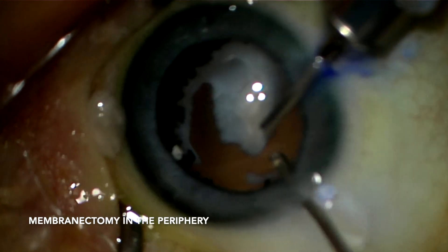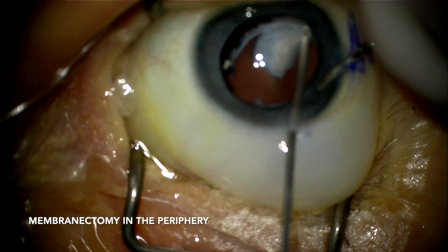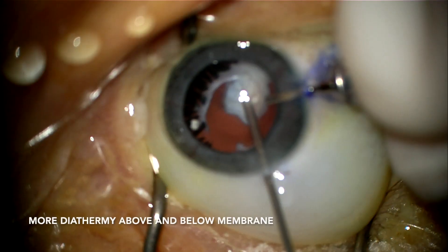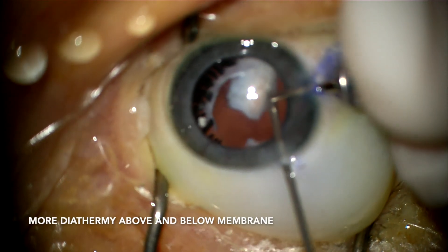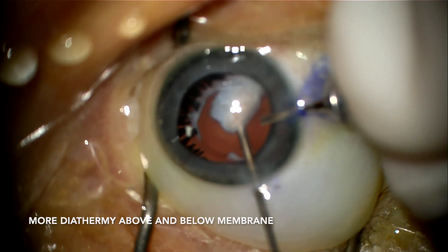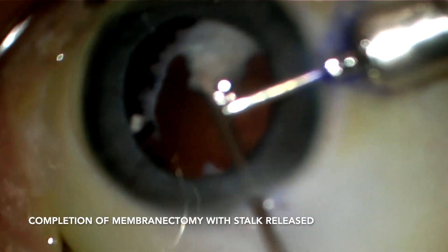The membrane is eventually freed from the superior aspect. More diathermy is used on the vessels, as well as on the undersurface of the membrane, in case there are more vessels posteriorly.